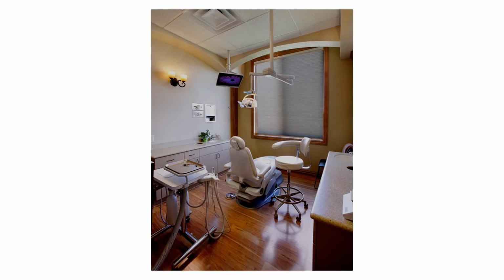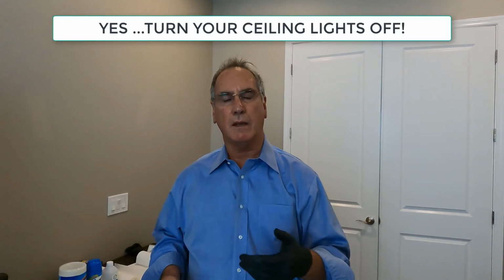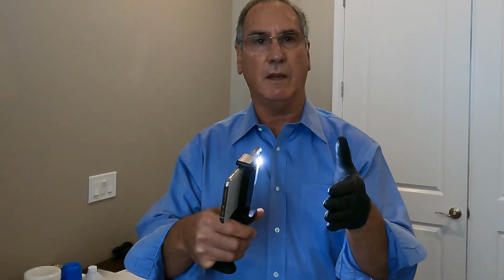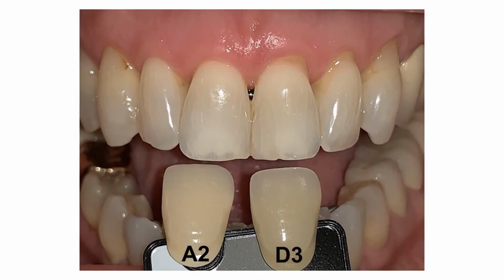Now we're not going to do that for this video simply because then you wouldn't be able to see very well. But with ShadeWave Mobile you can. It has a flashlight. I don't want to blind you, okay, a little bit, but it has a flashlight which lights up the teeth just great, and that way you don't have glare from the ceiling, you don't have glare from a big window, and you're going to send an excellent picture to your dental lab so they can do the very best work possible.